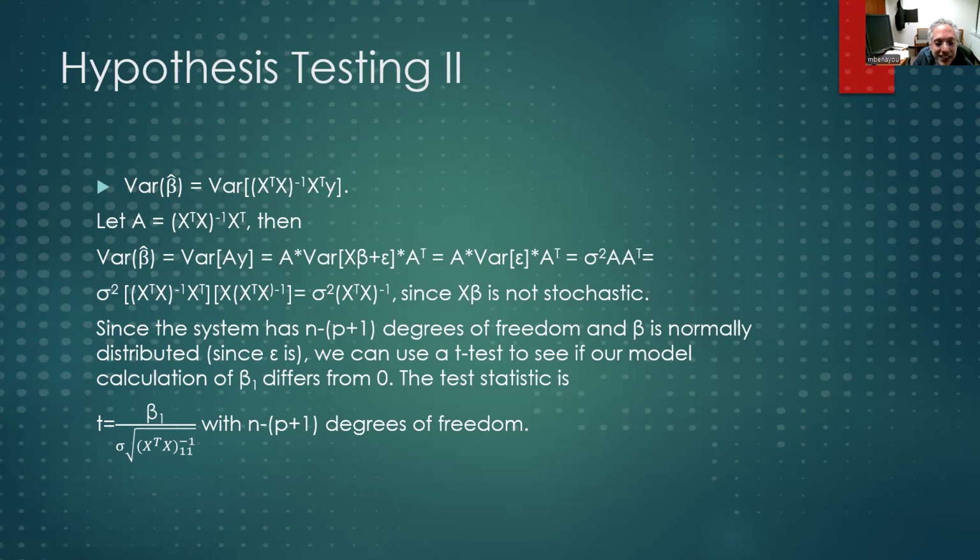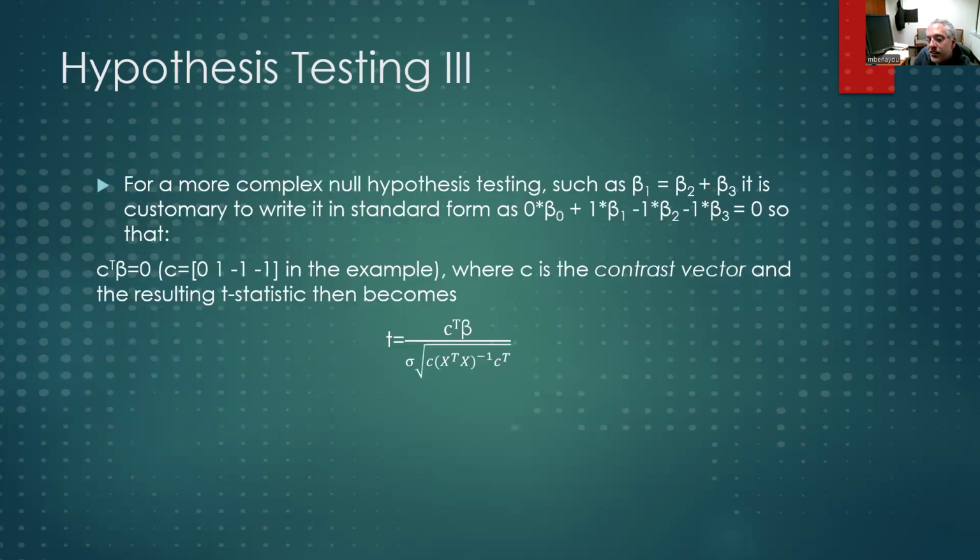And the idea there is that if I brought the patient back and did the exact same fMRI task, I wouldn't get the exact same BOLD signal the second time. There'd be some statistical variation, and so my beta value would be slightly different when I calculated it that time. We're never going to bring a patient back and do the experiment 100 times, but we do at some point need to statistically ask the question, if I did do it 100 times, what would the variance be in my measurement of beta? And that helps me know if my value of beta is statistically significantly different from 0.